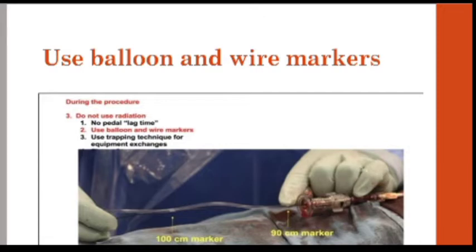Use balloon and wire markers. Do not use radiation. No pedal. Use balloon and wire markers. Use the trapping technique for equipment exchange.